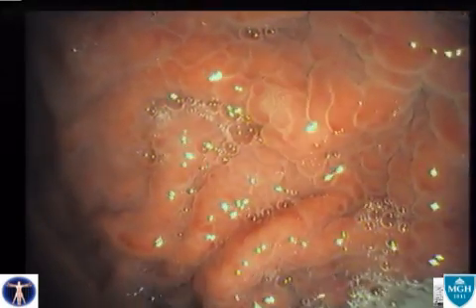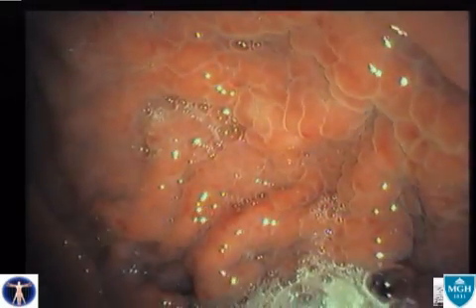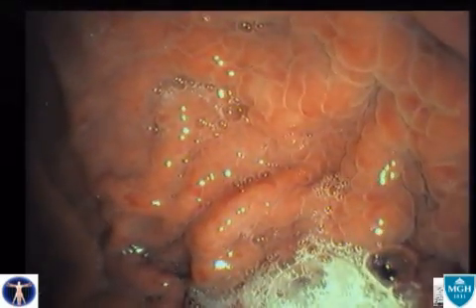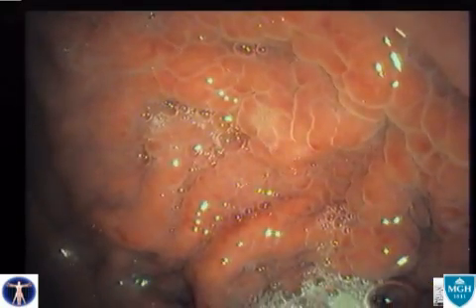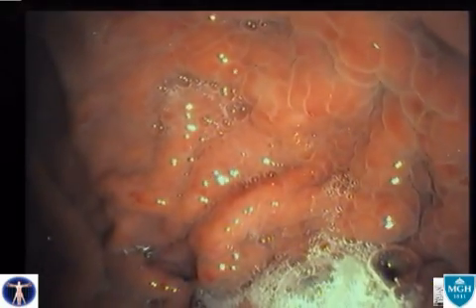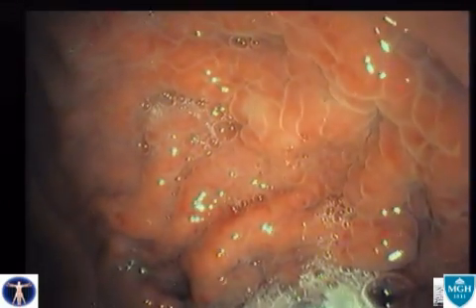This patient has cirrhosis, and this upper endoscopy demonstrates the classic snake skin appearance of portal hypertensive gastropathy, a condition associated with an elevation of the portal venous pressure gradient typically seen in cirrhosis. The mucosa has this beefy, engorged appearance.